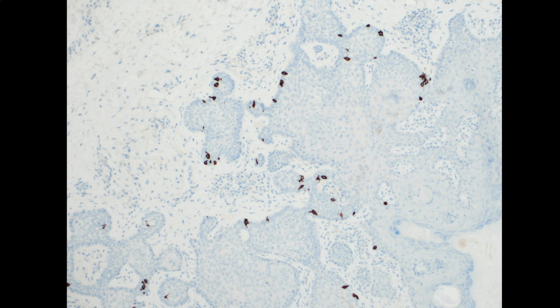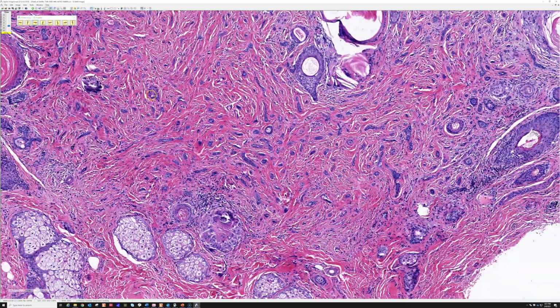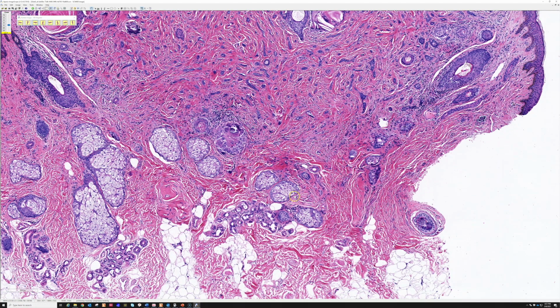I find that they often highlight the openings of hair follicles, and likewise you see them scattered in the midst of trichoepitheliomas, trichoblastomas, trichofolliculomas, and desmoplastic trichoepitheliomas. So it can be a really useful tool if you find a colonizing with these passenger benign Merkel cells on CK20 stain that's supportive of a benign hair follicle tumor. It's not a perfect stain, but of all the stains described and the ones that I've used in my practice, I've found this one often helpful. But more important than all of that is I want to see a biopsy that's deeper than the shave. I want to see the base of the lesion, okay?